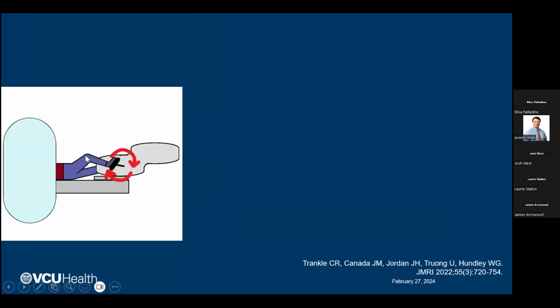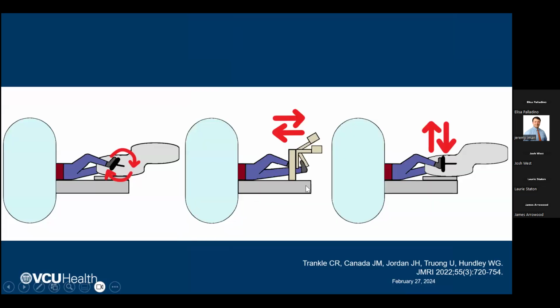And in terms of supine exercise, the bicycle is the most commonly deployed one, but there are other ergometers out there that are available. There's a step ergometer where you push repeatedly back and forth with your legs. There's an up-down ergometer. I think actually the knee is not usually bent with this. It's an up-down motion that you make on the ergometer.